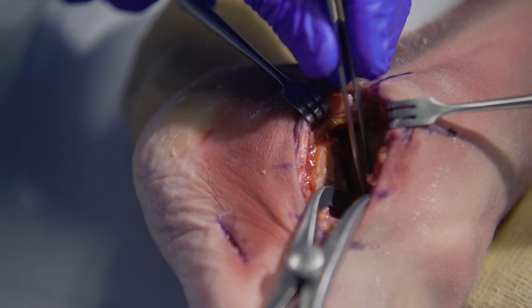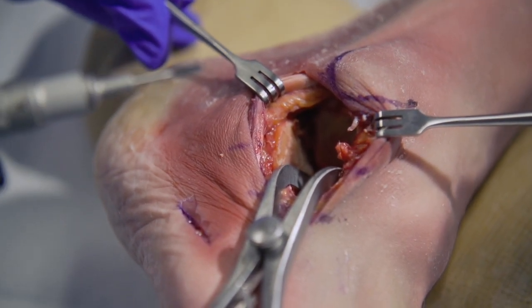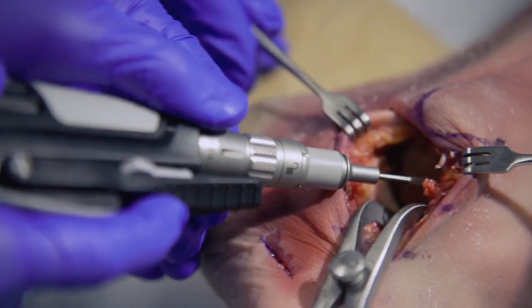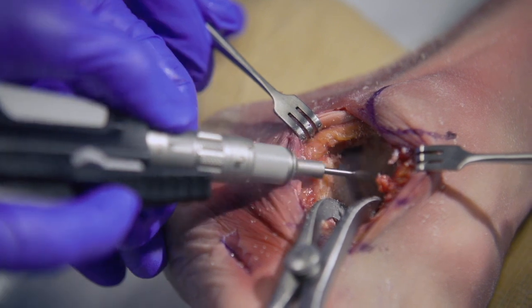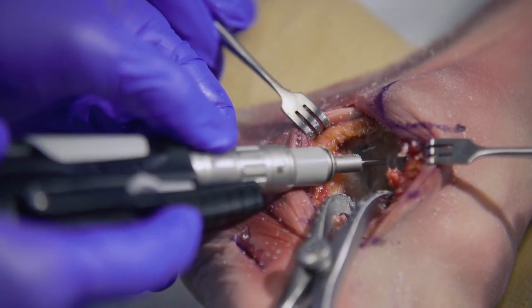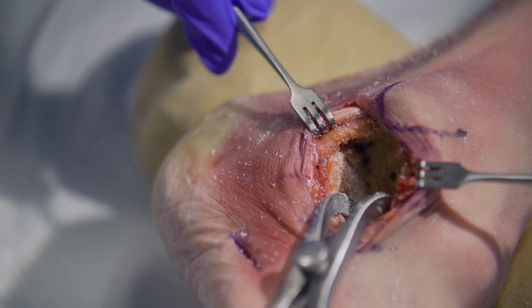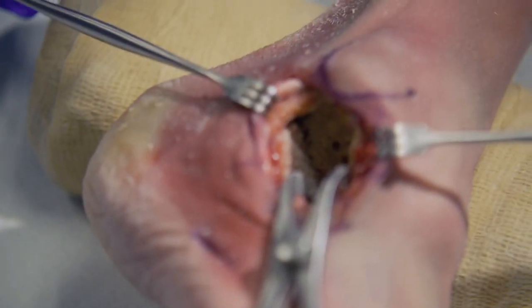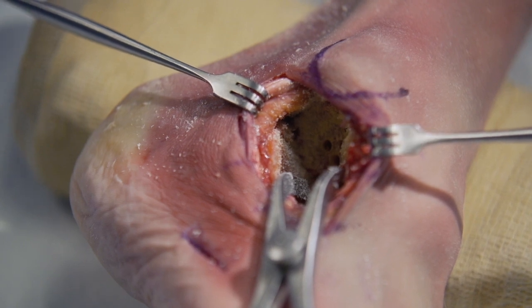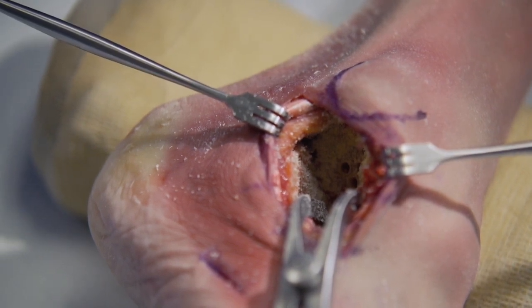The middle facet on both the talus and calcaneus sides have also been prepared. Fenestration or fish-scaling techniques can be employed to obliterate the subchondral bone plate. A joint preparation drill instrument can be utilized to prepare multiple holes to enhance the arthrodesis. It is important that the subchondral bone plate is fenestrated or fish-scaled with an osteotome to prepare for adequate fusion.